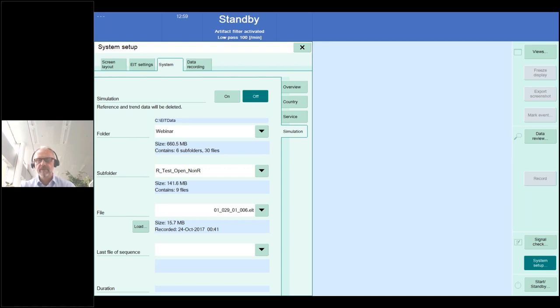I should also mention that, of course, because it's such a new parameter, there's not so much experience on that. But I have already drafted a guide on how to analyze the regional ventilation delay. It's not so much the quantification of those parameters, because they can change from PEEP level to PEEP level very easily, and they can go up and down depending on how large the transition zone between the collapsed and the open lung is. So I would currently, at least at this time, not recommend to only rely on the numbers of those parameters, but rather to interpret the patterns.